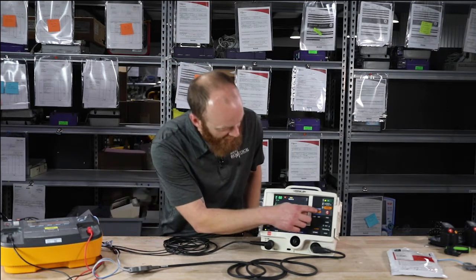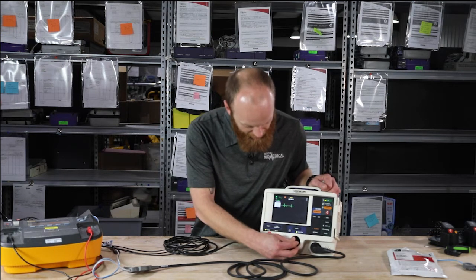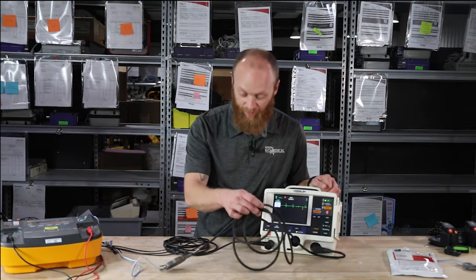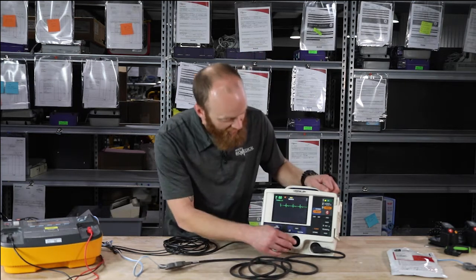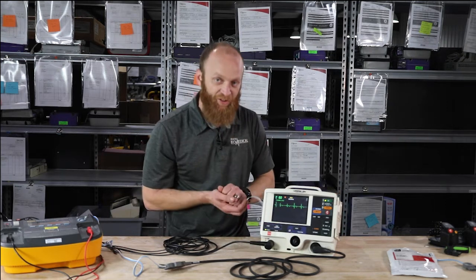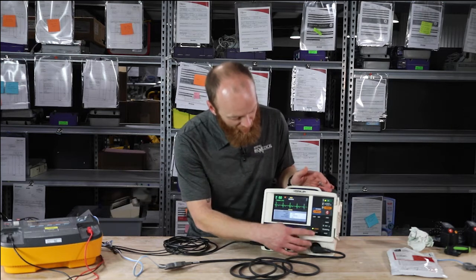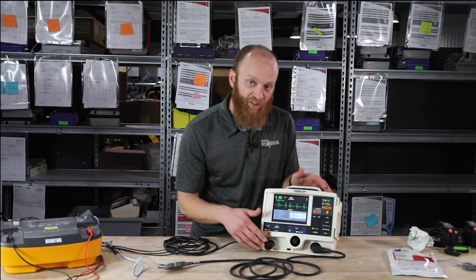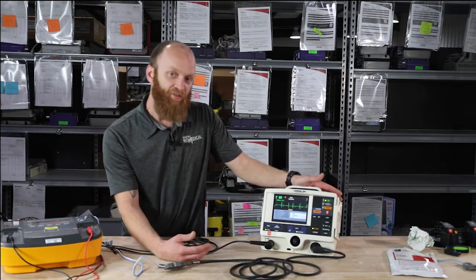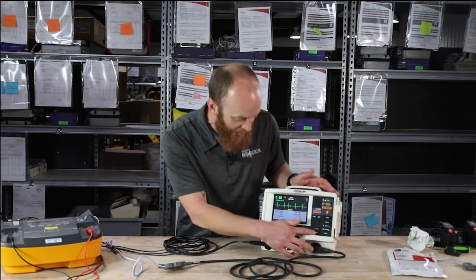We have the lead button, which allows you to scroll through lead one, two, three, or paddles — in this case your pads and therapy cable. The size button adjusts the amplitude of your lead. We have the alarms button where you can set your alarm limits, suspend alarms, set your VFib and V-tach alarm thresholds, and then the options button.